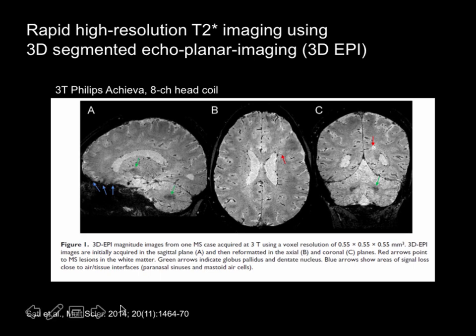And as you can see, it really has a nice contrast, so you can really pick out the blood vessels, but you can also find the lesions that we're after here in MS. And you can see the central vein running through the lesion in all planes. Because it's isotropic now, you can reslice the brain in any direction you want and track your vessel as a line or as a dot. And you can really convince yourself that it's actually in a central position inside the lesion.